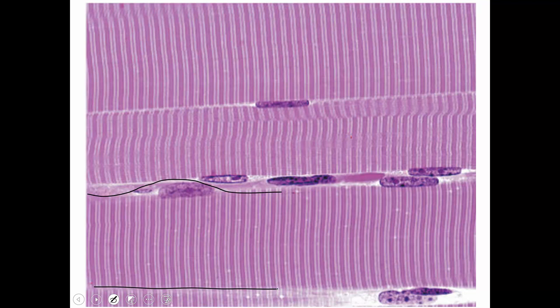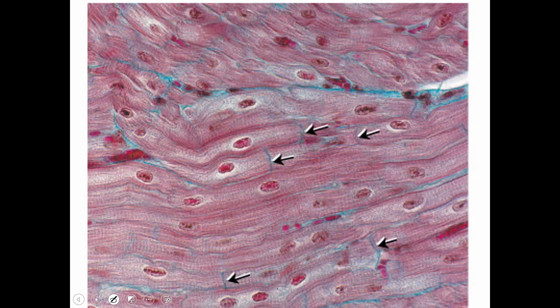This is the nucleus. It's peripheral. It's towards the side, right? So here's one type of striated muscle, peripheral nuclei. Here is another type of striated muscle, has striations in it. And look at this particular cell. So this is the plasma in this cell. Is that nucleus central or peripheral? Central. That determines, are you looking at cardiac or are you looking at skeletal muscle? You see what you're supposed to be focusing on? That's histology. Okay?